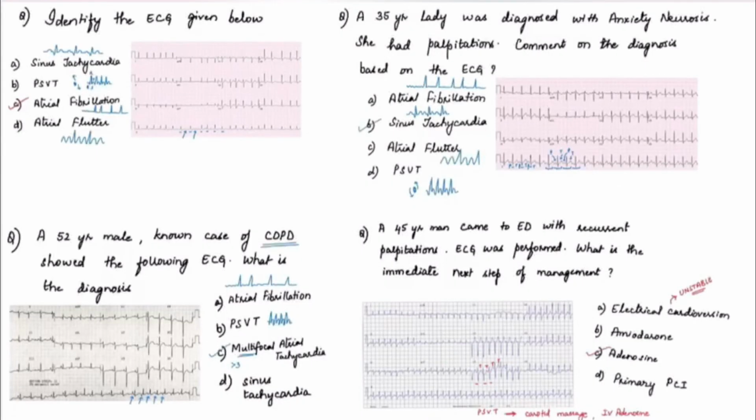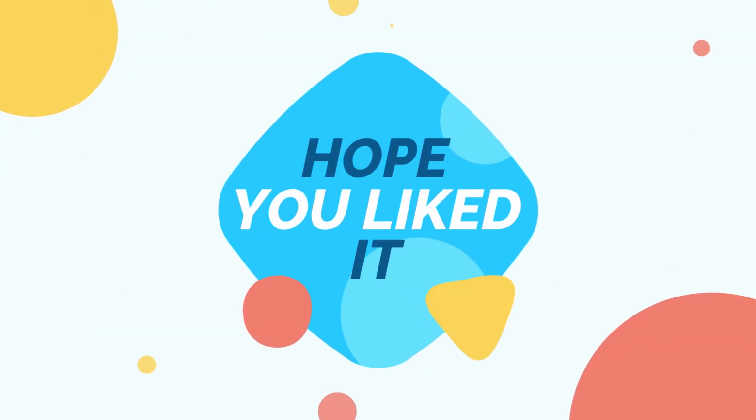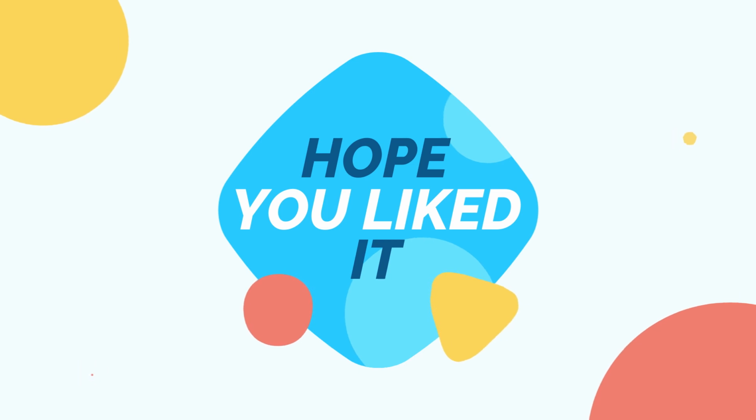Okay, so this was a quick look ECG session of narrow complex tachycardias. I just wanted to make the interpretation of ECG more simple, and I hope it was really useful to all of you. And that's all for today.